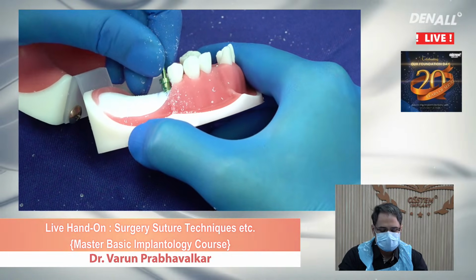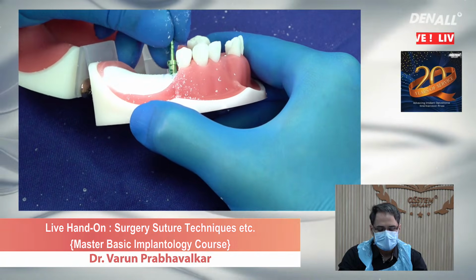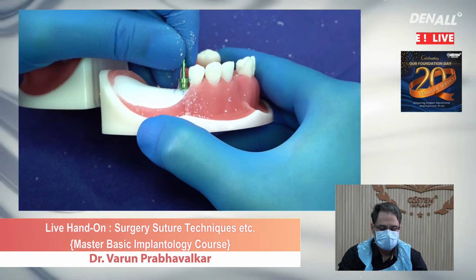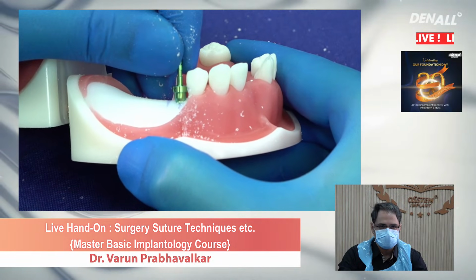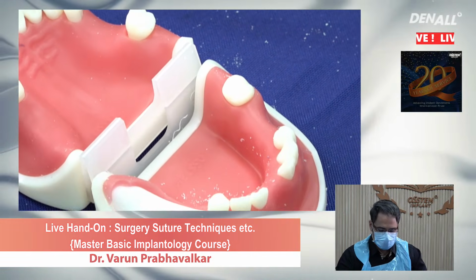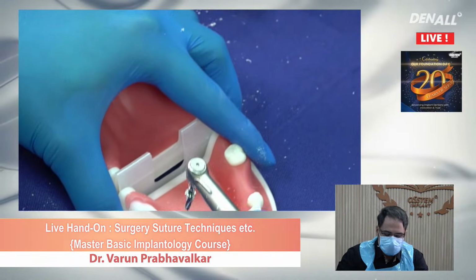So we can place this paralleling pin the reverse way, and you can check the osteotomy as much as possible. Okay, I'm quite satisfied with this osteotomy angulation. I'm just going to remove this and go ahead with our final drill.